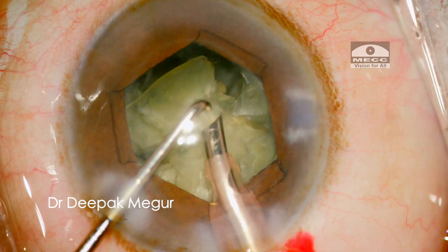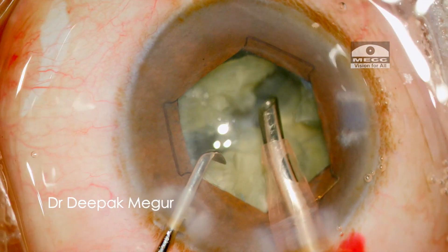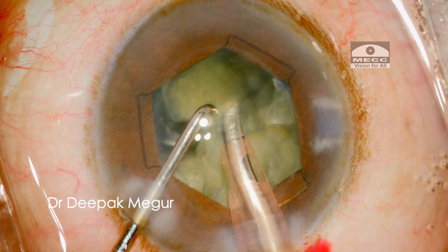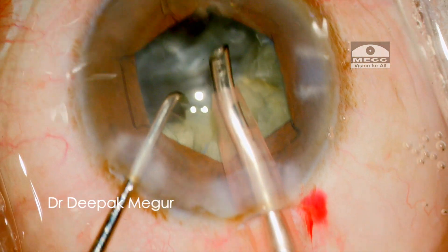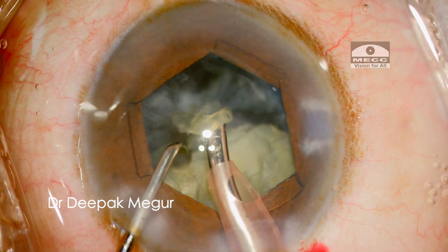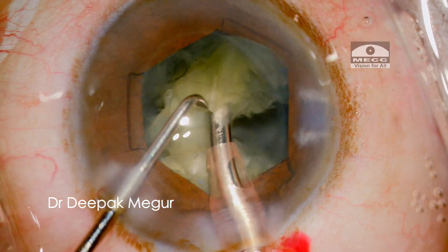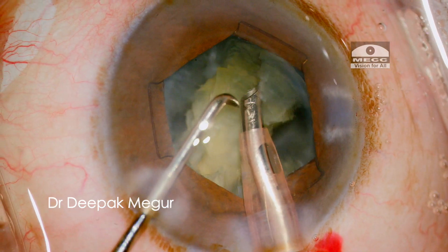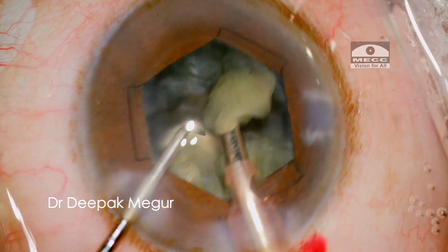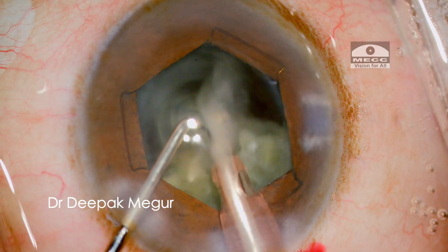Once I have around 6 pieces, I proceed to emulsify each of these quadrants. The principle I stress upon while emulsifying these fragments is to consume the fragments far away from the cornea — at a much more posterior plane. In this mid-dilated pupil, it's easier to appreciate the plane of emulsification. We can see the fragments moving around at the level of the iris plane. The phaco tip is present at the dead center at the level of the rhexis, and each fragment is individually consumed without causing much turbulence. My chopper is held slightly on top of the fragment, acting as a shield to minimize any chance of a tiny fragment flying around and hitting the cornea.